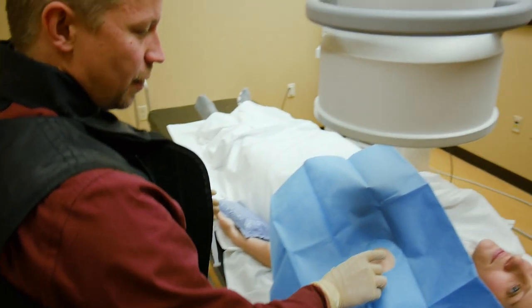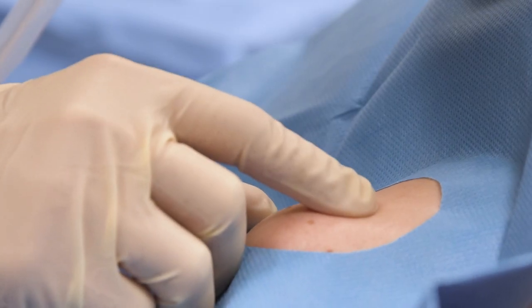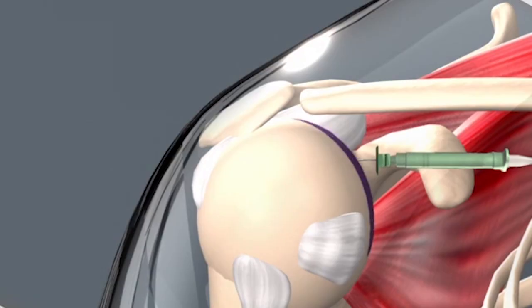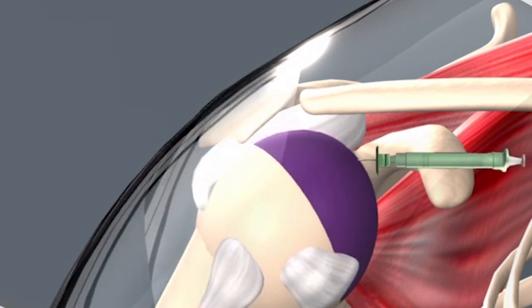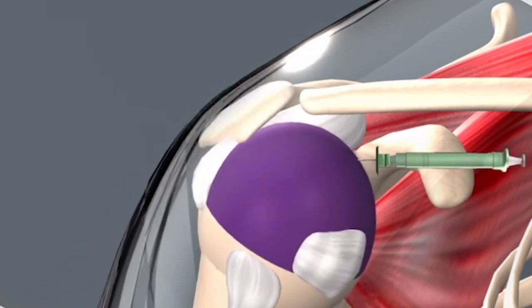We numb the patient up. That's the most important thing in the entire procedure — to get appropriate anesthesia. Once I have them numbed up, I have a very thin needle that goes down to the joint and I inject the contrast into the joint and distend the joint, kind of like a balloon. You fill it up from the inside. Patients usually tolerate that well. Sometimes patients feel a little fullness or tightness in their joint, but it's not pain — it just feels unusual, different.